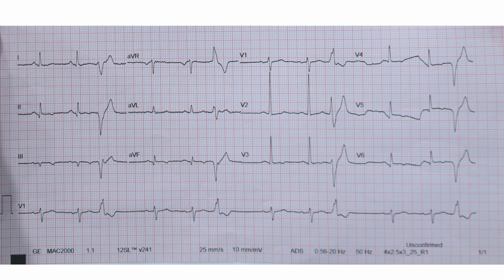We can see a QS from V4 to V6 in the PVC, which indicates that it's a mid cavity to apical region of the LV, which means left side. But QS till V6 means that it is mid to apical LV.